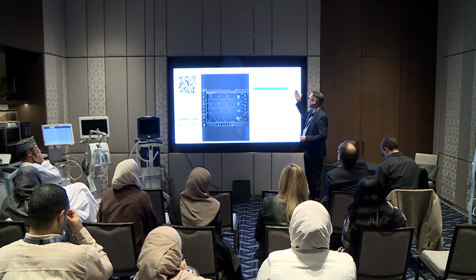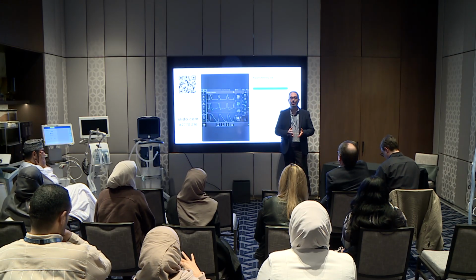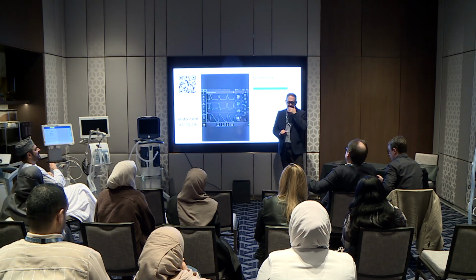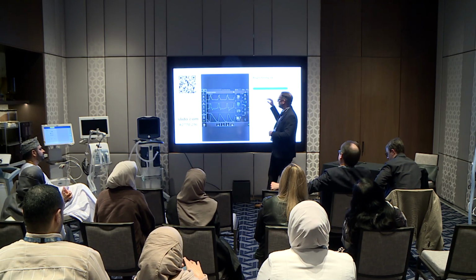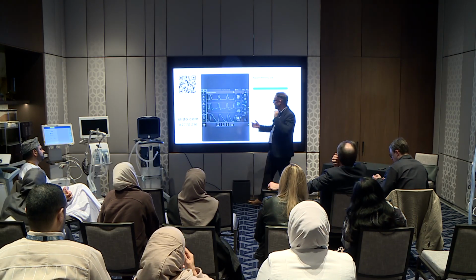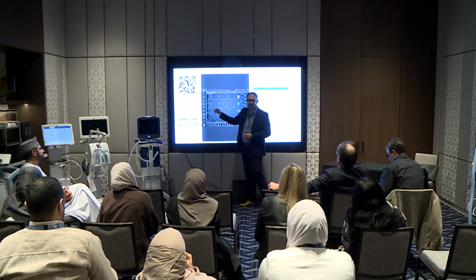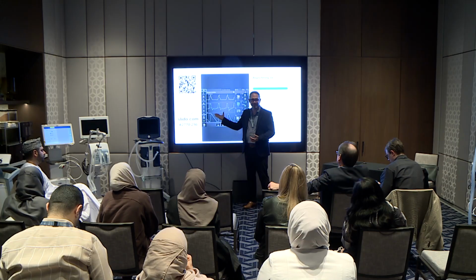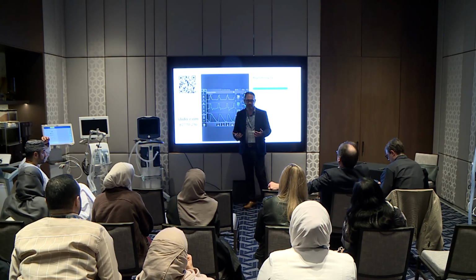So anyways, we have under assistance or over assistance. Reverse triggering is classified as the over assistance. Okay, so I gave away reverse triggering. You're going to know the next answer. So under assistance, I see no real evidence of under assistance. There's not even a drop in the pressure normally during inspiration. There's no trigger. So under assistance assumes the patient is being assisted, but they're not even triggering the ventilator. So it's not under assistance. It's under the classification of over assistance.